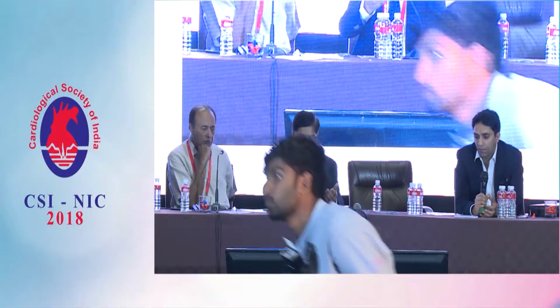The third point, which could be theoretically said, is if the left main is more than 5 millimeters in size. The OCT has a penetration power, to the best of my understanding, of about 5 millimeters. So if your vessel size is bigger than that, then it may not be able to see the lamina.